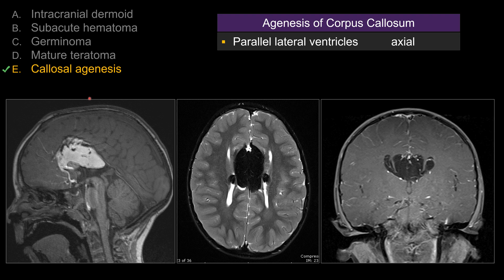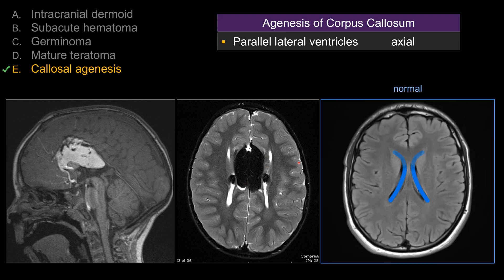One of the features quite classic for agenesis of the corpus callosum is on axial view, you see this parallel appearance of the lateral ventricles. For a normal case, the lateral ventricle has a crescent shape, and typically the body comes closer toward the midline. In the setting of agenesis or severe dysgenesis of the corpus callosum, you will see this parallel appearance of the body of the lateral ventricles, and they are typically much more widened compared to normal.